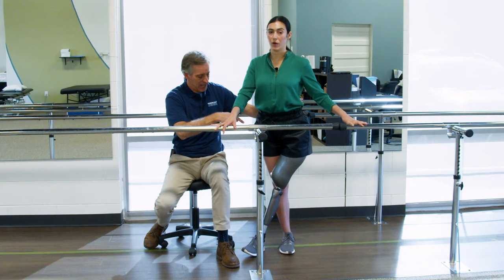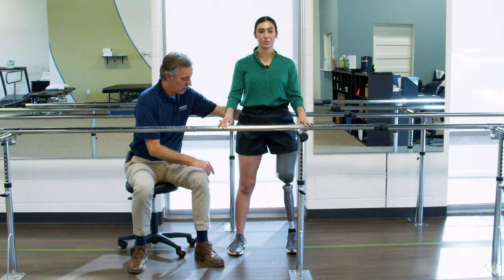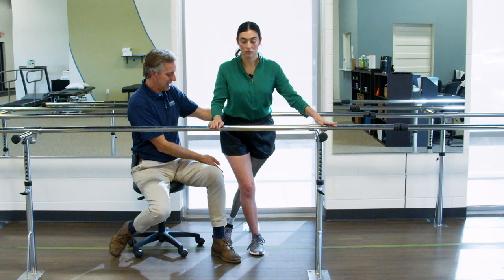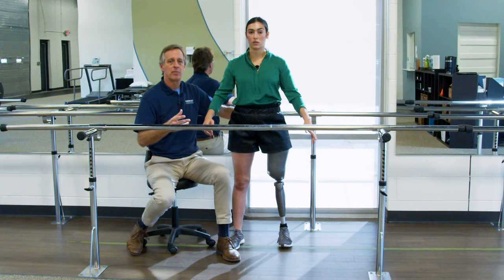It brings me up. Now, this one's even harder. Step behind. But don't go anywhere, but think about it. She can't see the prosthetic anymore. And if you're just starting, this is an odd feeling to say, I'm on this prosthetic limb, I don't really know. I can't see it, and I've got to really load it up and trust that when I put all my weight on it, it's going to be there for me. But that's really important, loading the leg in an awkward position.